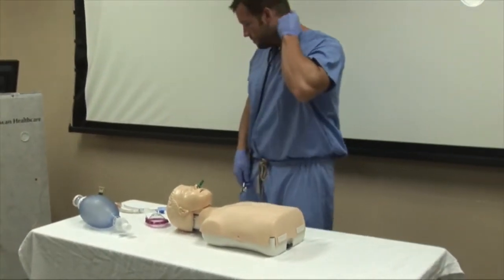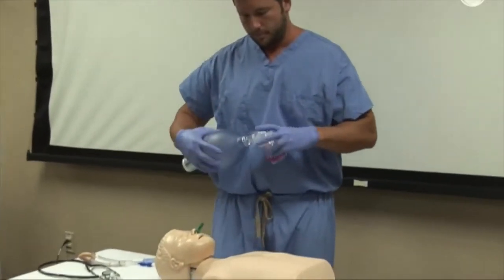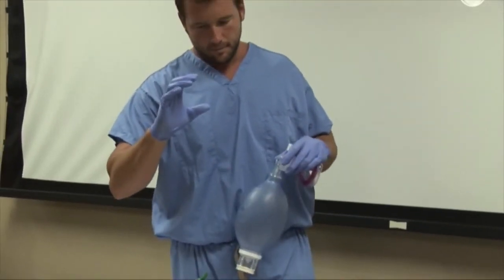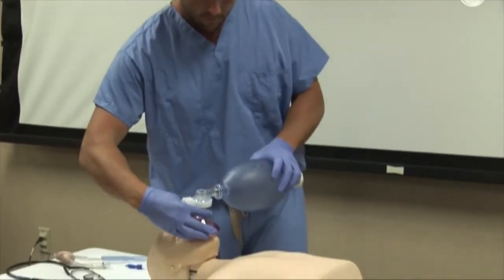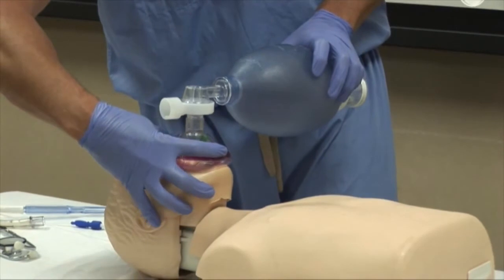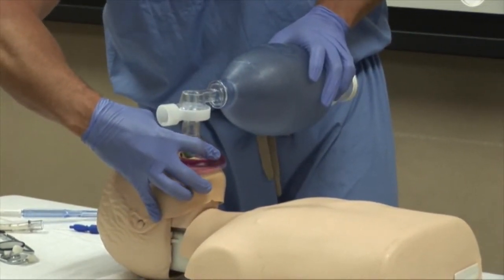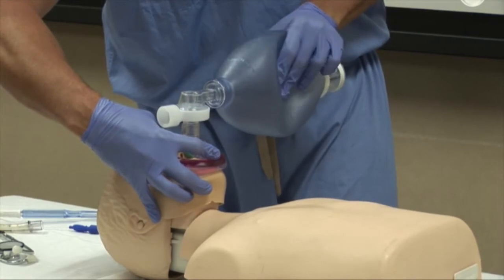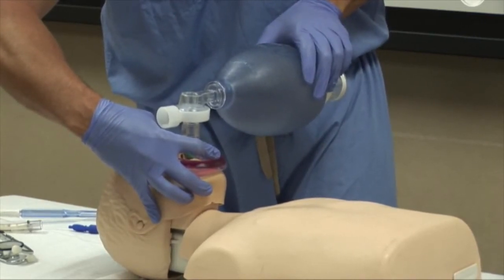To properly use the bag mask, use the EC formation with your hands. Form a C with the index finger and thumb of one hand on the top of the mask on the bridge of the nose — this securely applies the mask to the face. The three remaining fingers form an E and use these fingers to lift the jaw, opening the airway. Maintaining this position, the provider squeezes the bag, taking one second to provide one ventilation.